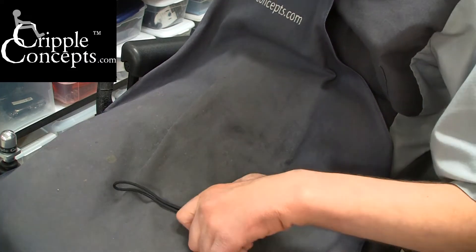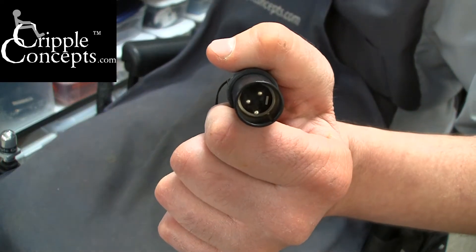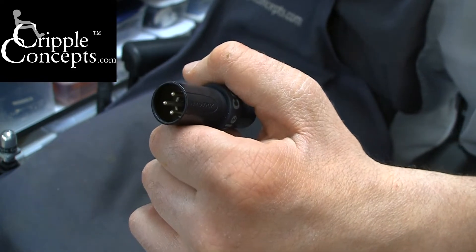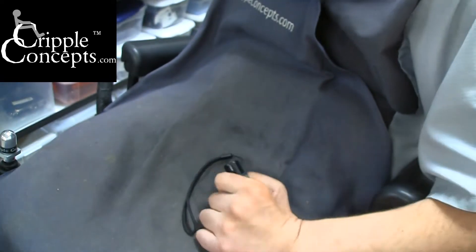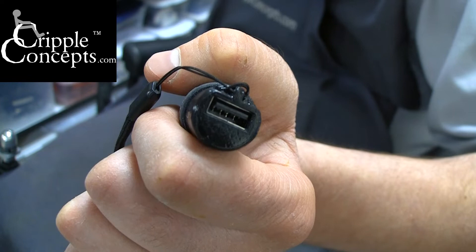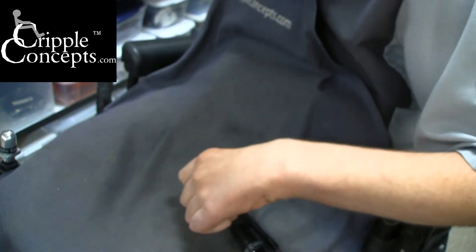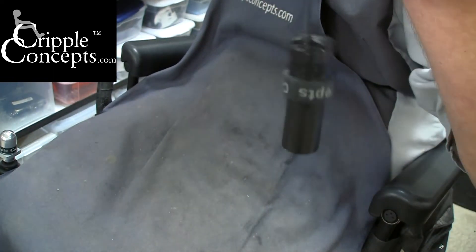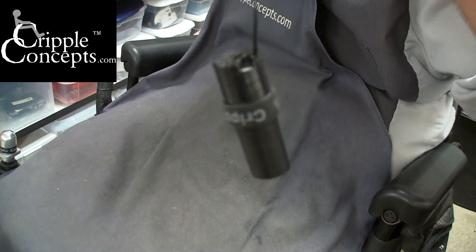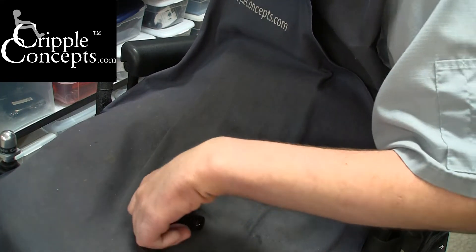The Cripple Concepts USB Charger for Power Wheelchairs and Scooters is a simple device that has a 3-pin XLR connector used on most power chair and scooter charge ports. On the opposite end is a USB Type-A connection, which is used on most device charging cables. There's a lanyard attached for easy carrying, making it easier to pull it out of the chair if it's stuck in the charge port. In the middle there's a silicone band with the Cripple Concepts name on it that helps with grip when you need to remove this from your power wheelchair or scooter port.